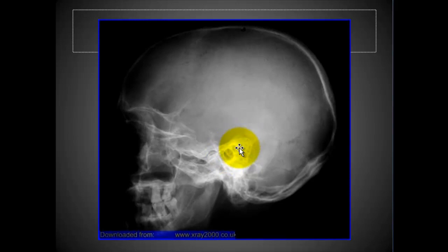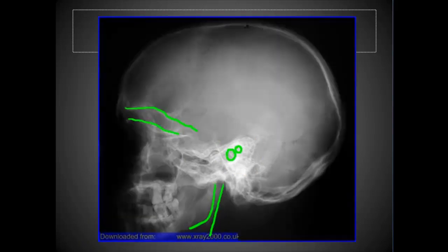So two fixes here — we need to tilt the head back to the right, and we also need to rotate the patient's head to the left to move it back in alignment with the other EAM. Looking at the orbital roofs and mandibular rami drawn here, they're not superimposed in either plane — confirming both tilt and rotation.